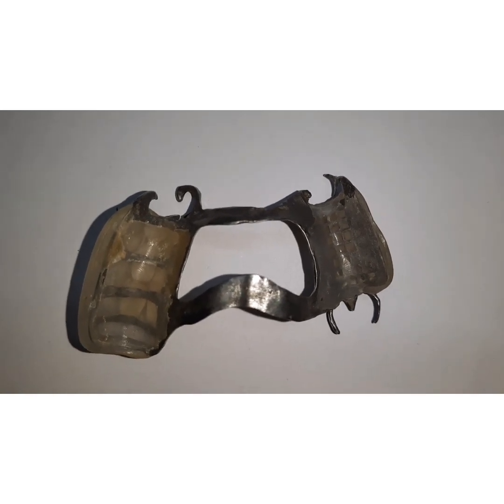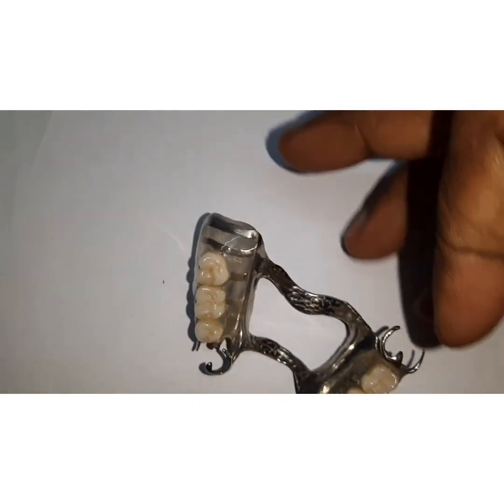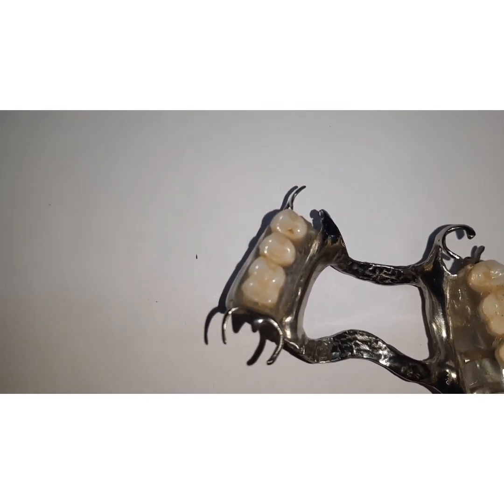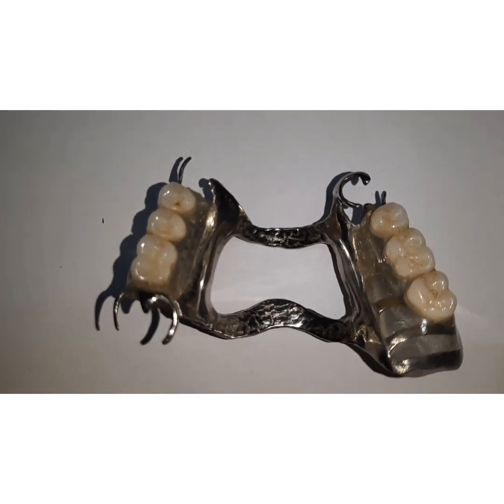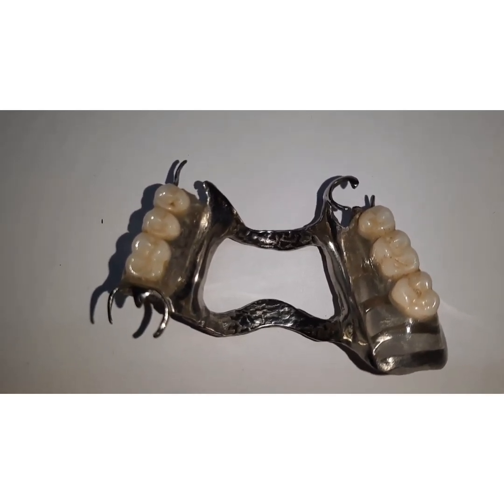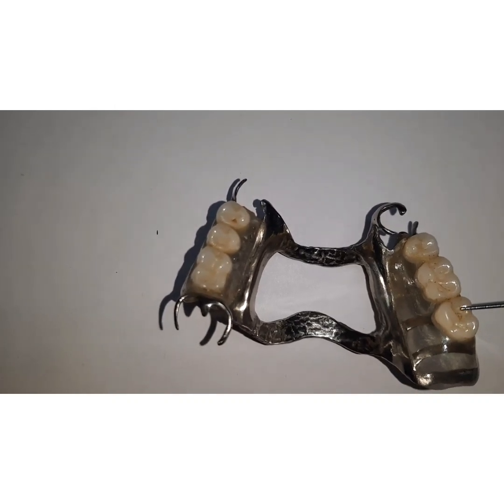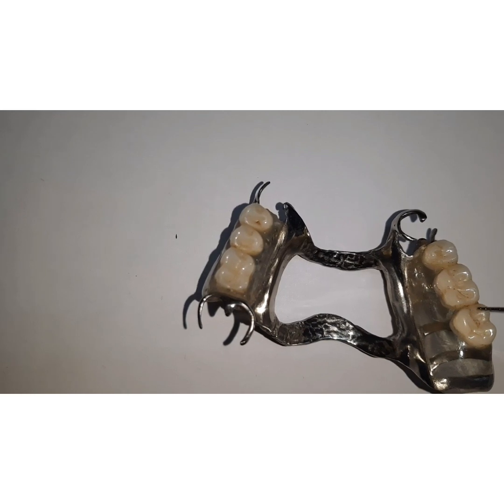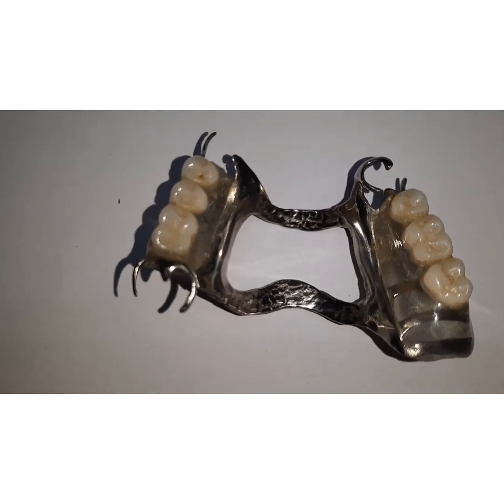Next kind of troubleshooting could be the occlusal discrepancy. At the time of insertion, occlusal discrepancy can occur on the artificial teeth, which you can see here. As the patient bites, there could be some premature contacts, and if there are any, you have to check them with the help of articulating paper, and grind them. Whenever we are grinding, you should use a selective grinding approach. In this, you have to reduce the cuspal inclines, not the cusp of the denture. Because if you reduce the cusp of the teeth, then you will actually be compromising the vertical height of the denture. That is the reason you should grind the cuspal inclines or deepen the fossa, whatever the case may be. Accordingly, you can adjust and address the occlusal discrepancy problem.